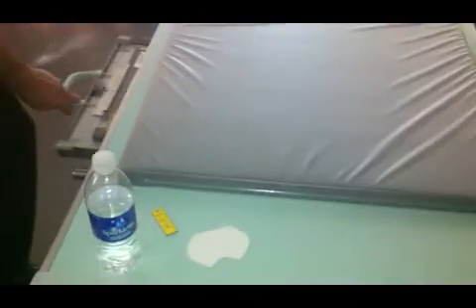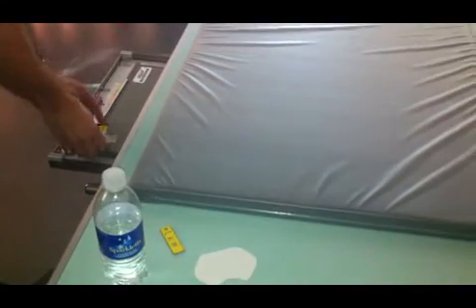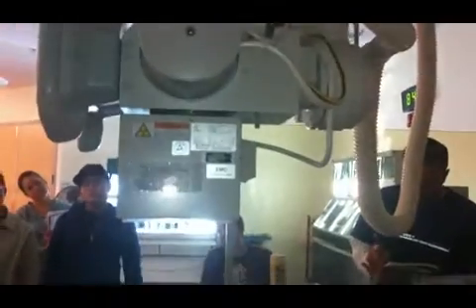Down the middle. Marker. Down low. Okay? So a lower outside portion. Usually you use your right marker because that's closer to you, assuming your patient's going to lie head down this way. Slide in there. That might be a little thick, so I have to take some of this stuff off eventually. Okay, so lined up, centering's all set. Okay, so all you're going to do is do the table.